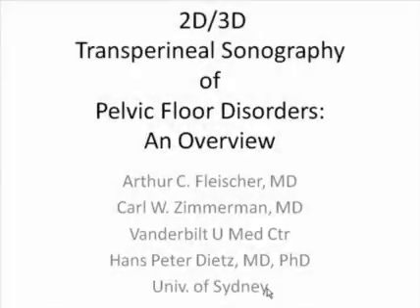This presentation will discuss and illustrate the role of 2D and 3D transperineal sonography in evaluating women with pelvic floor disorders. I want to thank my clinical colleague, Dr. Carl Zimmerman at Vanderbilt, and also acknowledge the input from Dr. Dietz, who is an expert in this area at the University of Sydney.